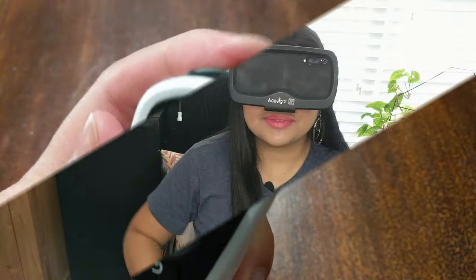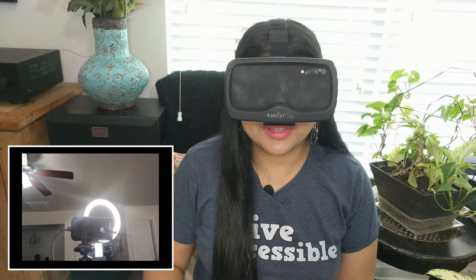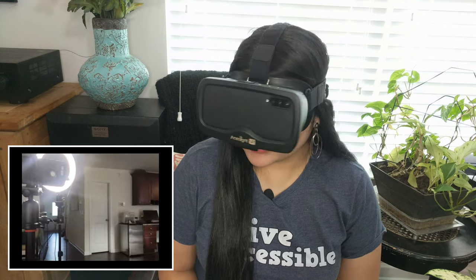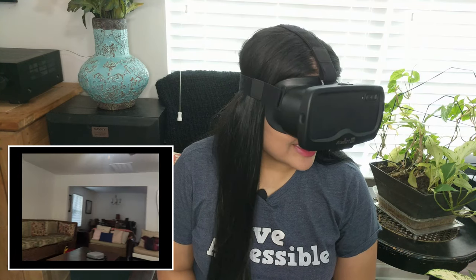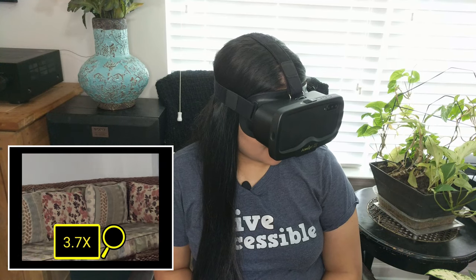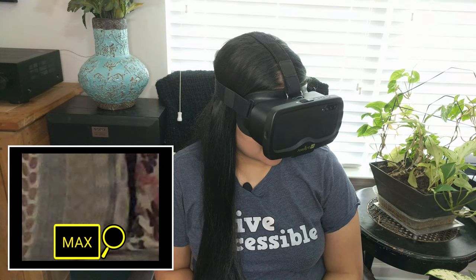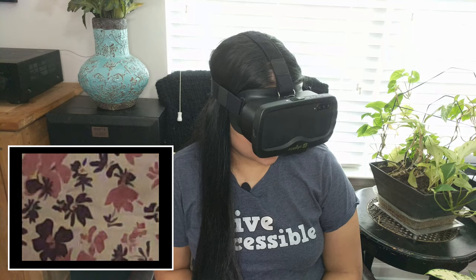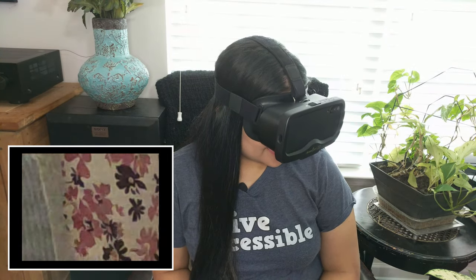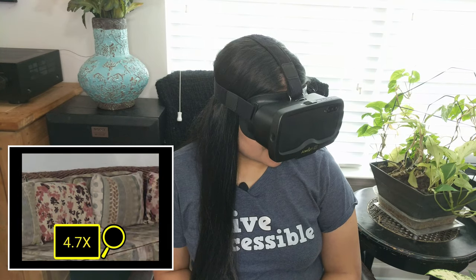So now I have the Acesight VR on, so that way you guys can see what I'm seeing. So I'm going to look around here of my living room, and I'm going to zoom in over here all the way, and you can see the details of the cushions that we have on our sofa. And so you can zoom out.